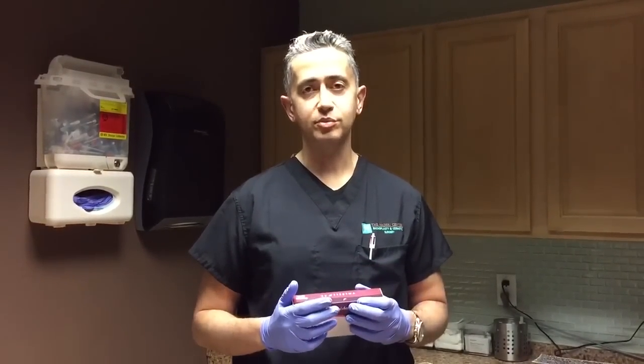If you want to go from thin to extremely full lips, you have to do it in sessions. For example, look at Kylie Jenner. Everybody knows Kylie's lips, but if you look at her starting point, this was done over multiple sessions. You have to inject it every 3 to 4 weeks apart. You have to do it 3 or 4 times. You can't just force 3 or 4 cc's into the lips. So patient expectation is important.